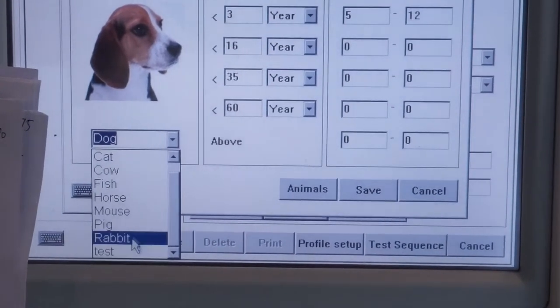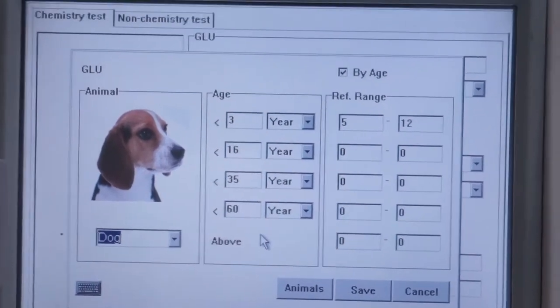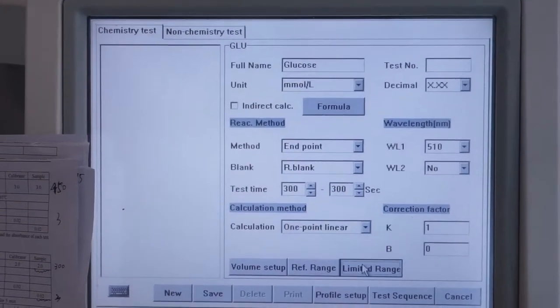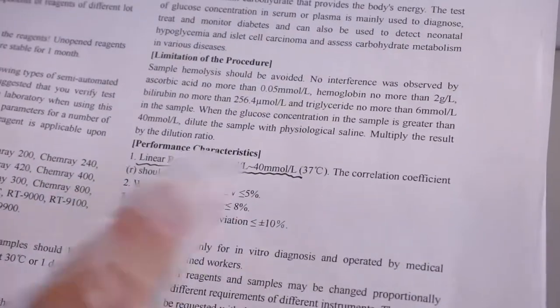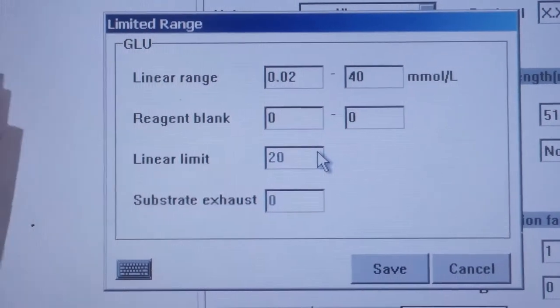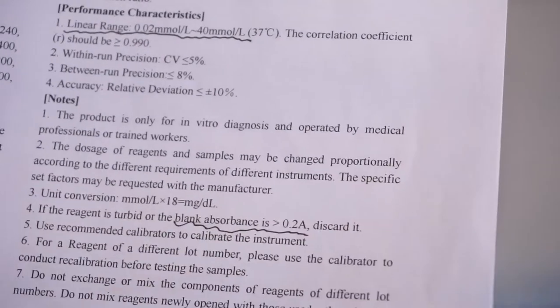Checking here, glucose. How to get a glucose concentration? You can see the concentration of calibrator. We use the calibrator to do the calibration, right? So this is what we know. And also the absorbance of the calibrator, we will test in the machine, and we know this value, right? After the calibration, we will know this factor. Then we test the sample absorbance, get the absorbance, and multiply by the factor, and we get the concentration of glucose. So from here, we use the endpoint for the test.